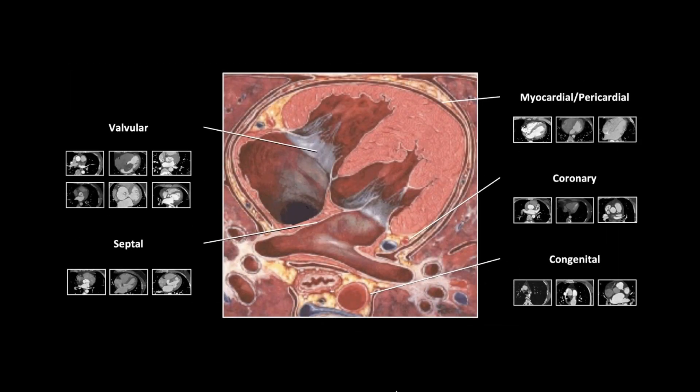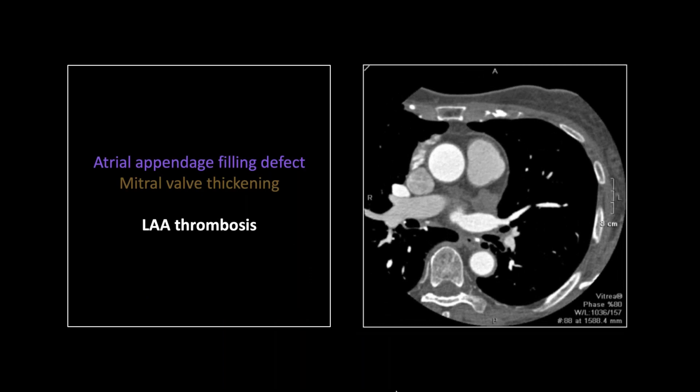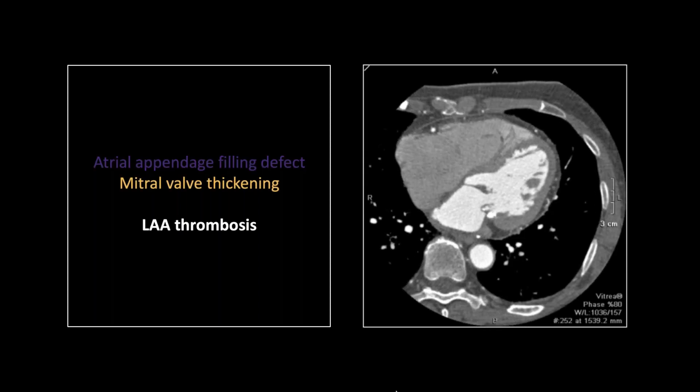Let's move to some valvular stuff. We've already seen a few valvular complications; we're going to round that out with some gated studies now. So this is a favorite in all courses in coronary CTA — they will throw one of these in — and that's the atrial appendage filling defect. This one is complete and unquestionable: this is a clot. These can be tough, and I'll show you some other examples where they're pretty tricky. Look at the mitral valve cusps: they're thick, they're irregular, they're calcified, they're completely asymmetric. This one is not tough to call mitral stenosis on. They're also a little too close together.